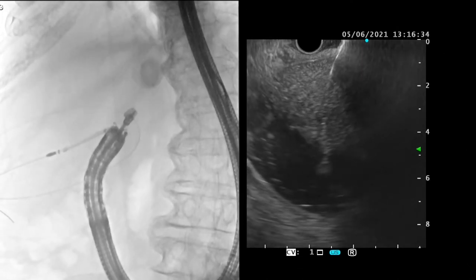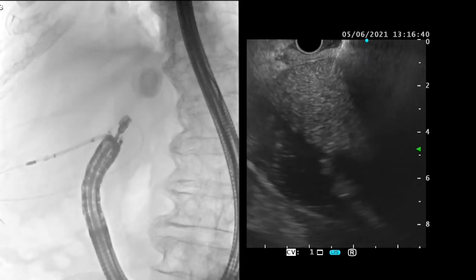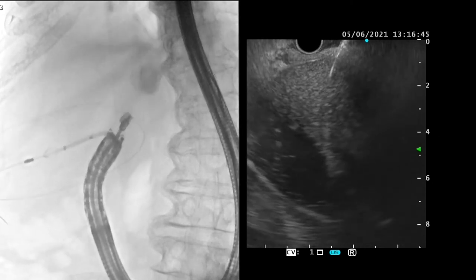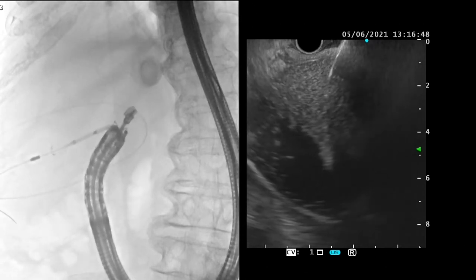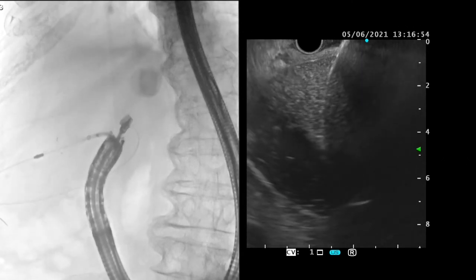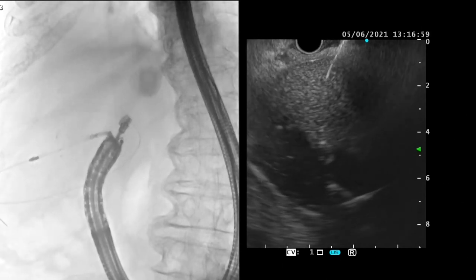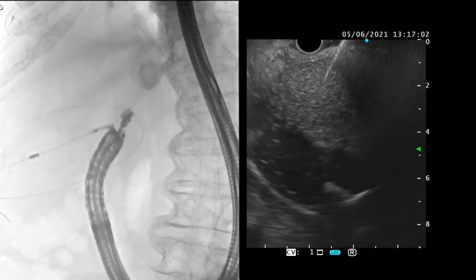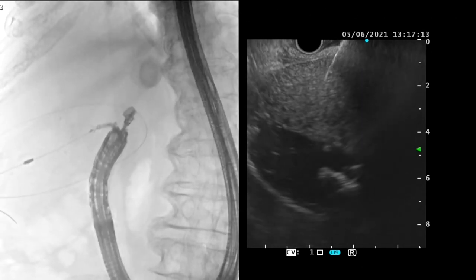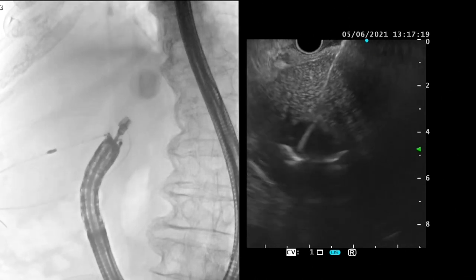The stent is steadily being opened — this is a hot stent. The stent is opened by the assistant. You can see three marks, and this stent was opened to the middle mark, and right there I was pulling back my stent. On the EUS image you can see the flange coming into view. The stent was half opened, so I positioned the half-opened point at the junction between the gallbladder and the duodenum. Thereafter the stent was opened in the channel of the echo endoscope and pushed out into the duodenum.